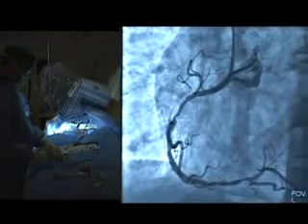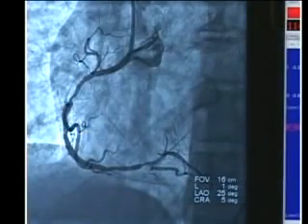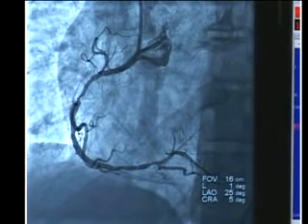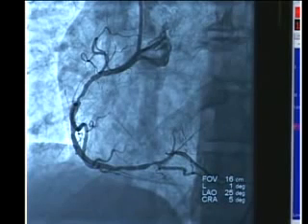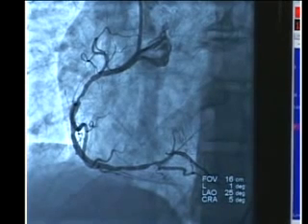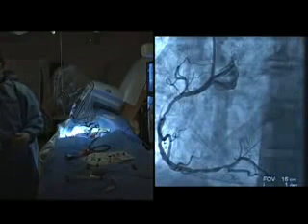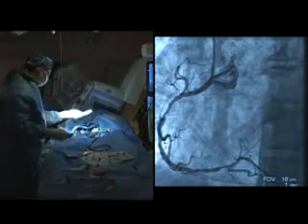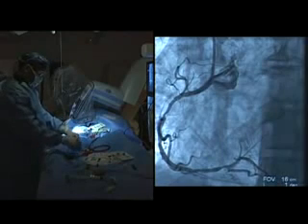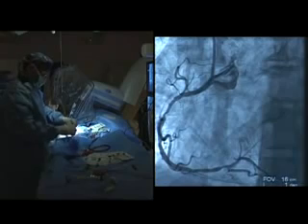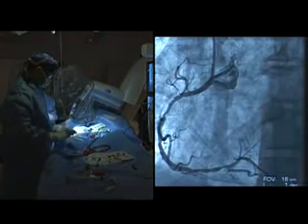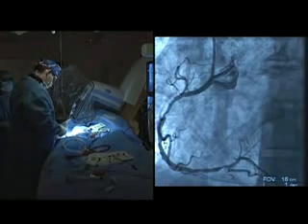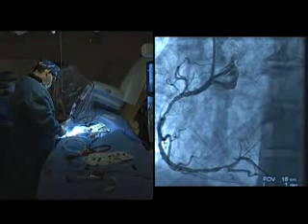Now that we have blood flow down the artery, we're going to finish the procedure by stenting the vessel, and it looks like it needs stents in two spots. There's a large amount of what we call thrombus burden in this vessel, primarily because it's an acute problem. This happened over the last couple of days, culminating in a prolonged episode of chest discomfort today — the artery was completely closed, causing a heart attack. Knowing clinically that there was a lot of clot in there even though we couldn't see it, we used the clot-removing device first. If you don't do that, you can get into a lot of trouble and have a very difficult time opening the vessel.